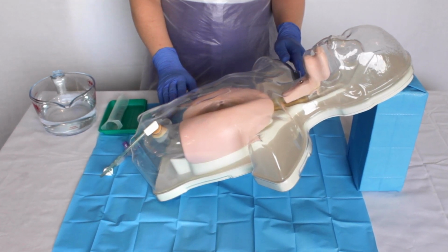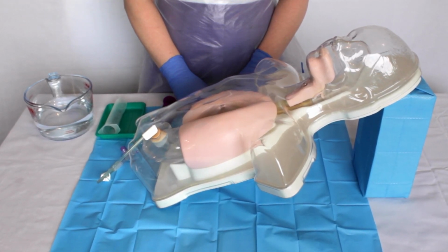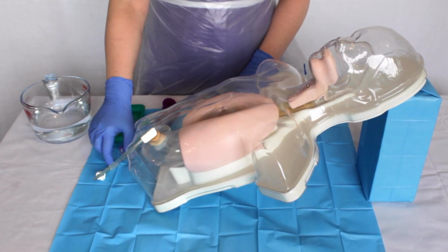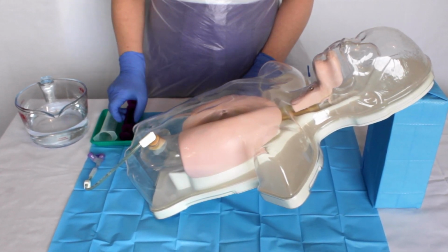Always flush the feeding tube before and after the administration of any feed or medication. Ensure the whole length of the feeding tube is cleared to reduce the risk of blockages, and always follow the flushing regime recommended by your managing healthcare professional.